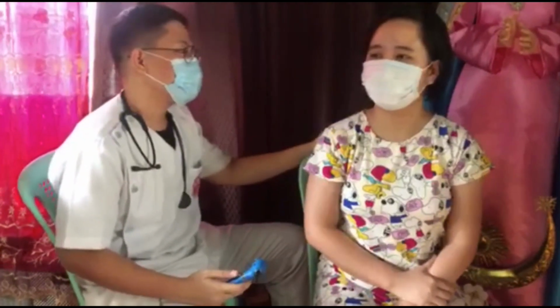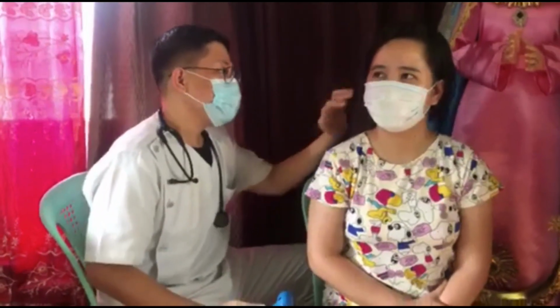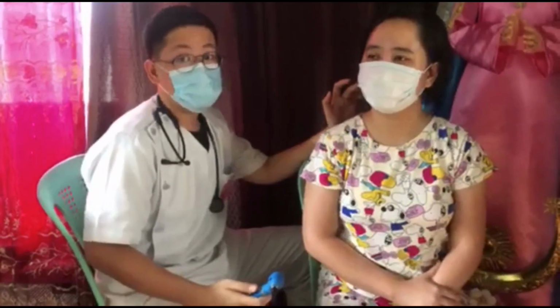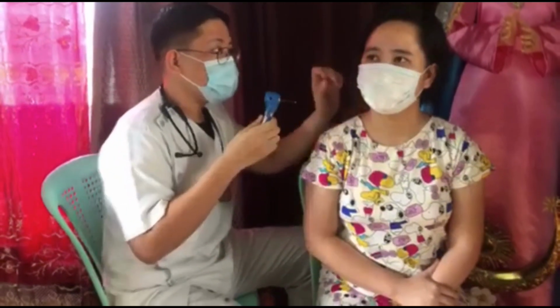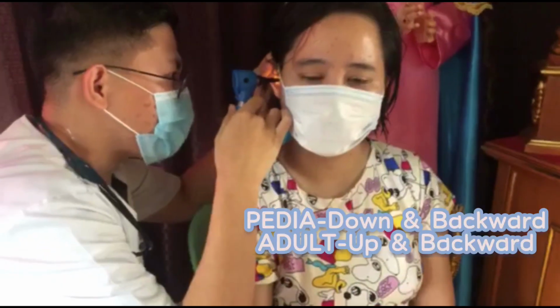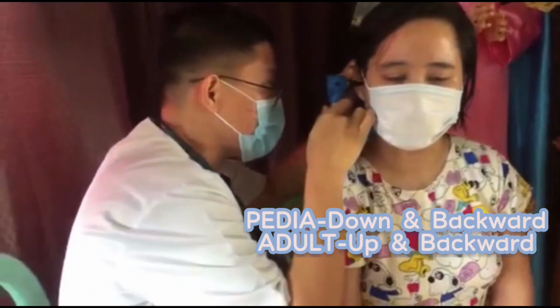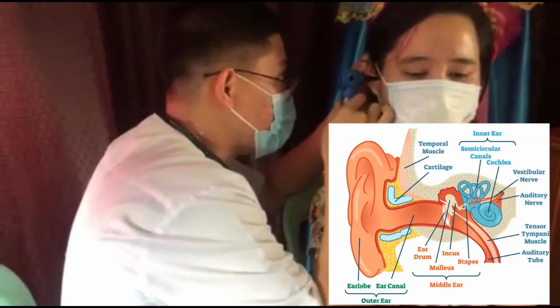No. Alright, okay. So for the otoscopic examination, you should first check the outer ear and also the mastoid process for any signs of otitis externa. If there's none, you can proceed. So shine the light inside your patient's ear, pulling the auricle upward, backward, away from the head of the patient. Check the ear canal for any signs of redness, cerumen, discharge, etc.